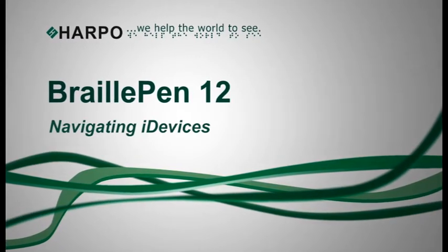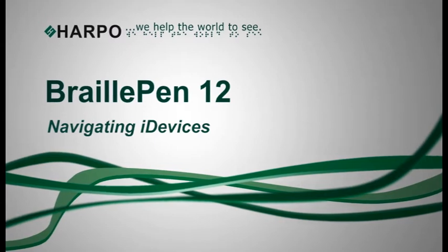BraillePen 12. Navigating iDevices. Let's find out how to navigate within an iDevice using the BraillePen 12.